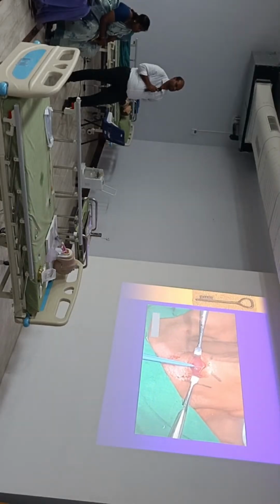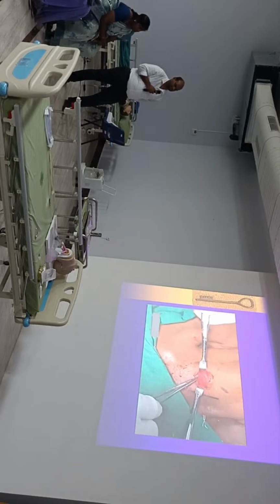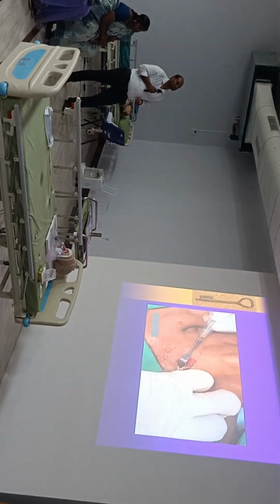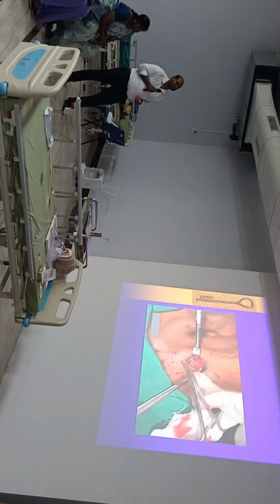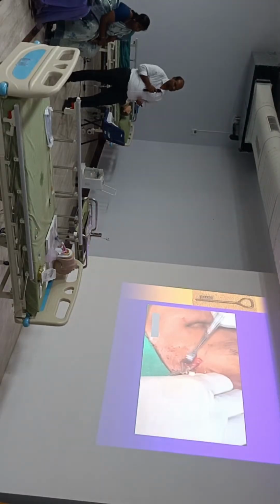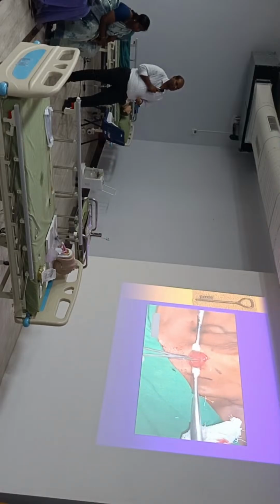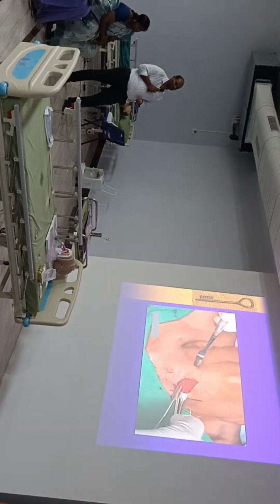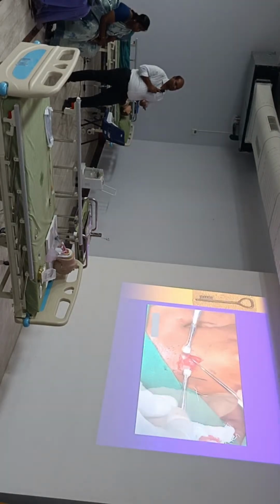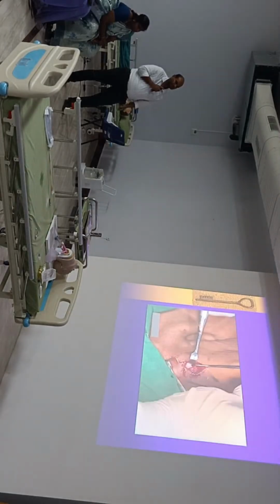We observe a little bleeding, which can be cauterized using the bipolar cautery. Now all the bleeding is stopped, and we are retracting again and going deeper, and the strap muscles are retracted and fascia is dissected. Our aim is to reach the white structure we see here, which is the trachea. And that's it, we have got the plane there.